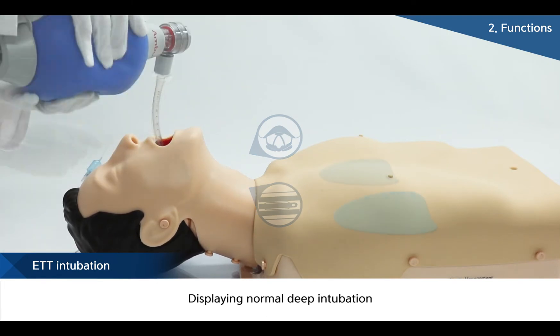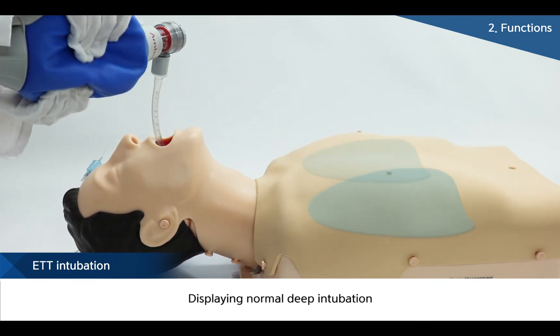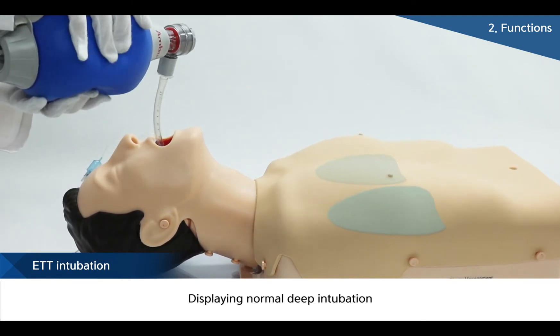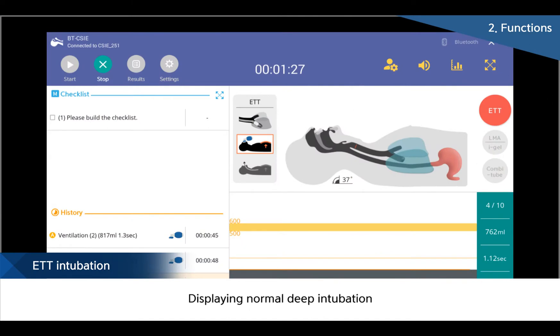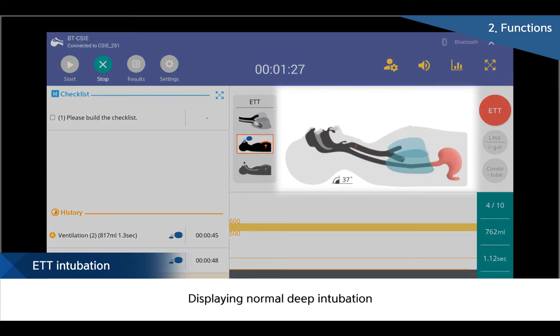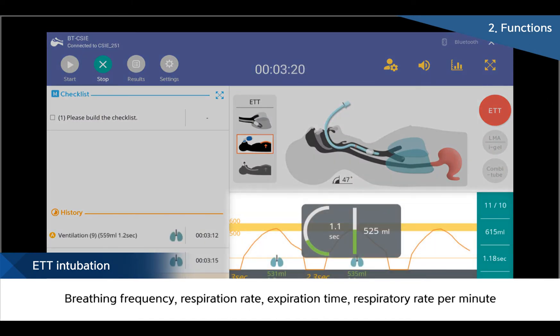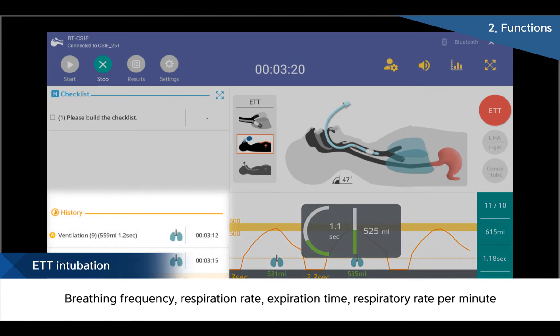Like in a real situation, an ET tube can be inserted. While inserting the ET tube, its depth also can be checked through the monitor. Volume and rate of air through the tube also can be checked through the monitor.